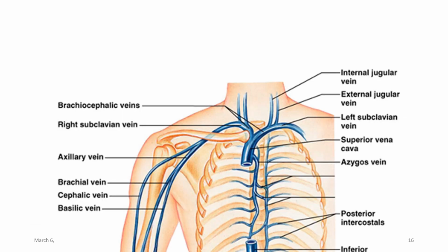Okay, now from your brachiocephalic, then we can go out to our subclavian. Again, the subclavian part of it, the proximal part is typically going to be above the clavicle, but then as you can see in this image, it's going to dive below the clavicle. So again, you may have challenges in documenting compression with your subclavian vein here, and so you're going to be highly reliant on angling the probe under that clavicle and utilizing your color imaging to make sure that you're assessing it correctly.